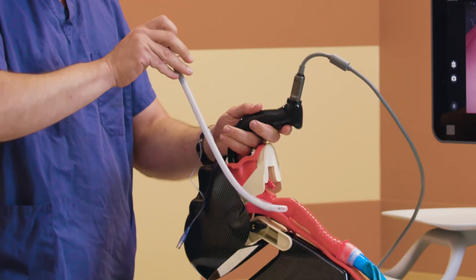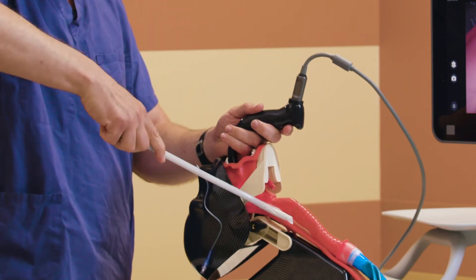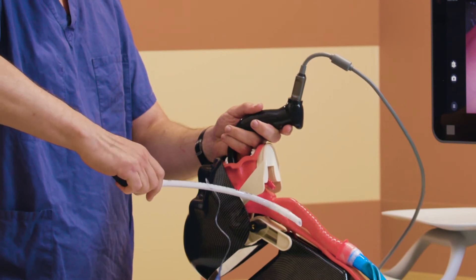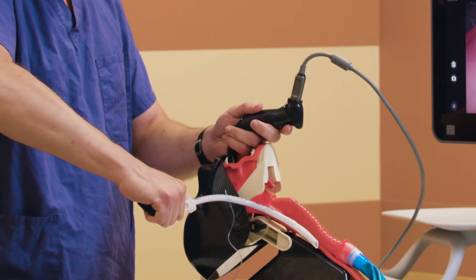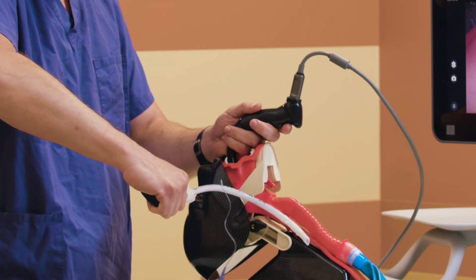So by changing my grip and coming over the top, that rightward twirl changes the inclination of the tracheal tube. So as I push it down, it is now matching the inclination of the trachea.